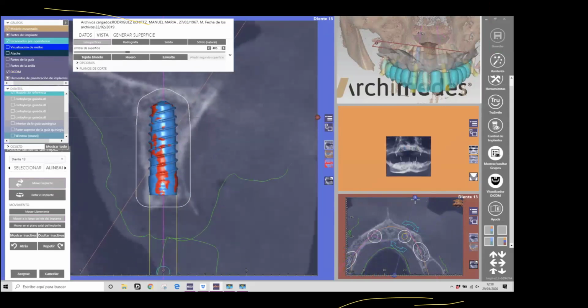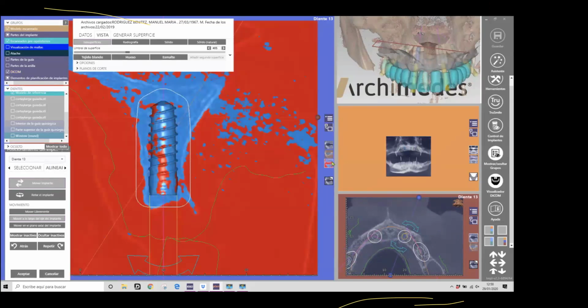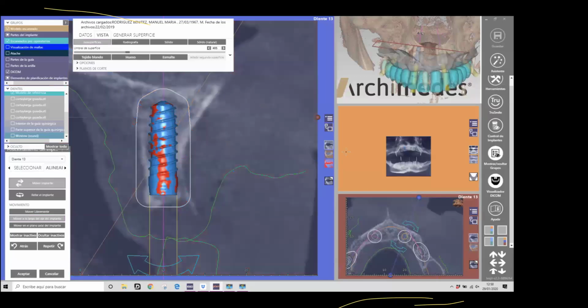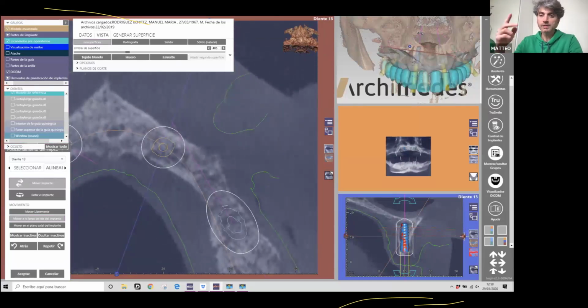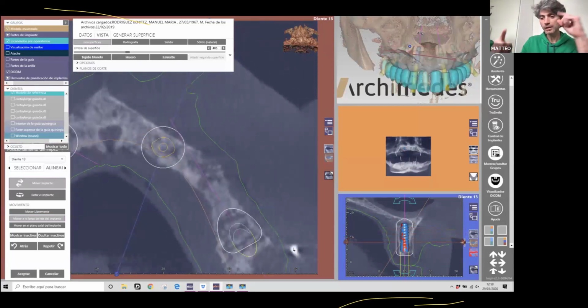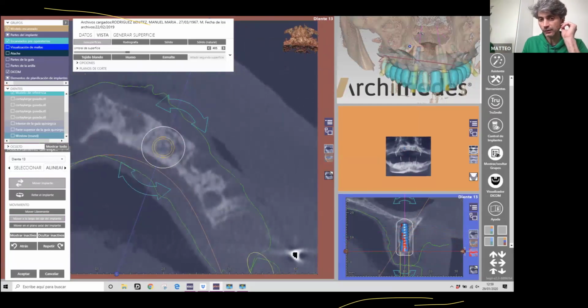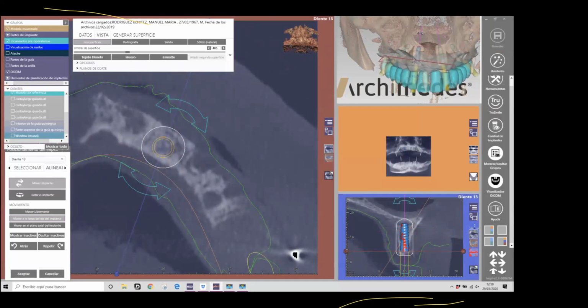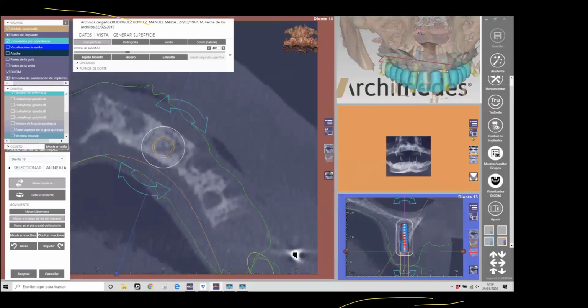Мы выстроили те зубы, которые мы хотим получить. Планируем установку 4 имплантатов, 2 имплантата во фронте в позиции латеральных резцов и 2 в дистальных отделах. And 2 distal implants in an angulated position, a tilted position, avoiding the sinus. Дистальные имплантаты будут расположены под углом для того, чтобы избежать проведения синус-лифтинга.